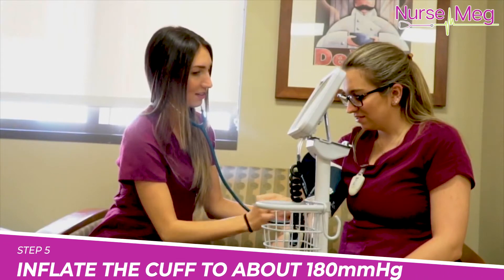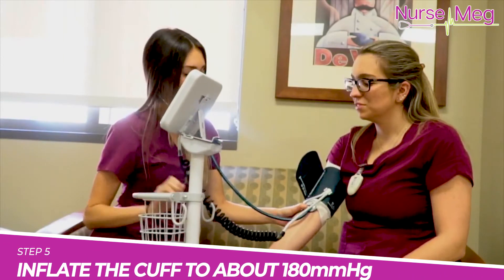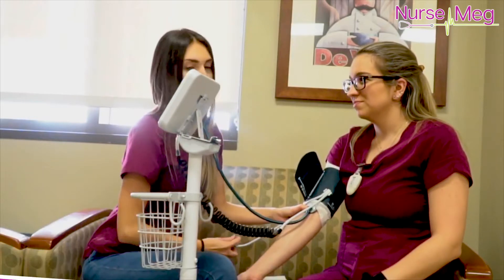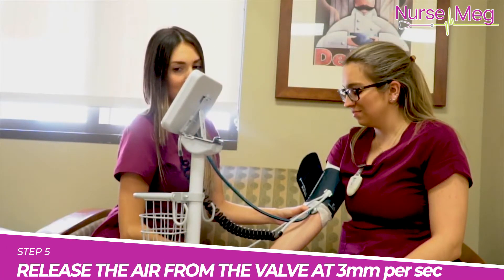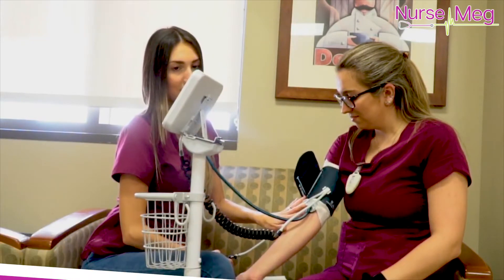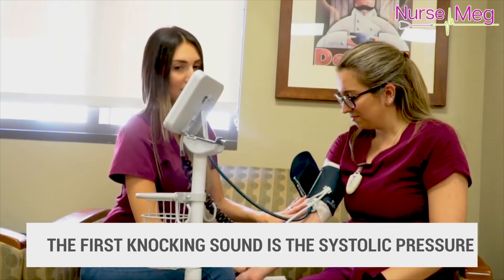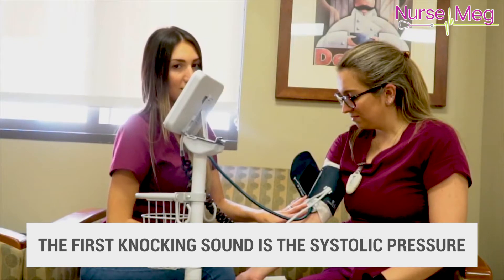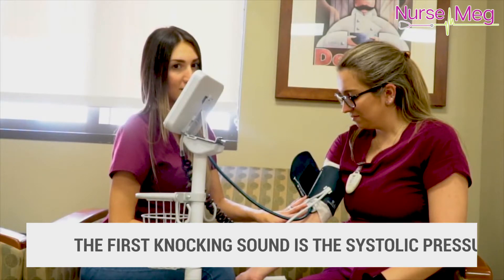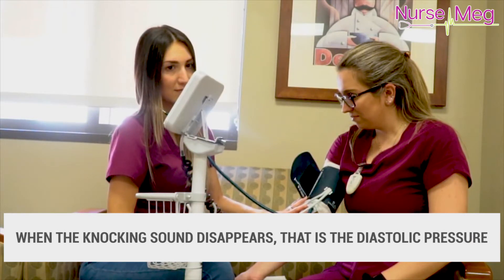Rapidly inflate the cuff to about 180 millimeters of mercury or higher, and then start to release the air from the air valve really slowly at about three millimeters per second. Listen with the stethoscope and simultaneously observe the dial. The first little knocking sound is going to be the systolic pressure — the top number. When the knocking sound disappears, this is the diastolic pressure — the lower number.